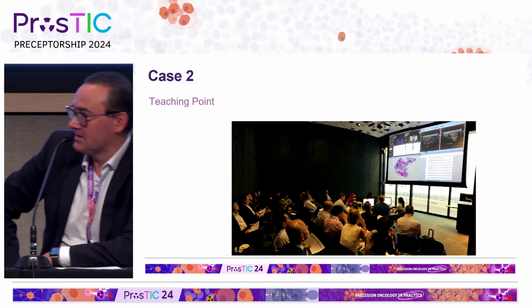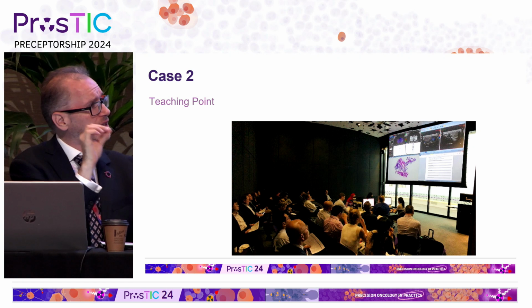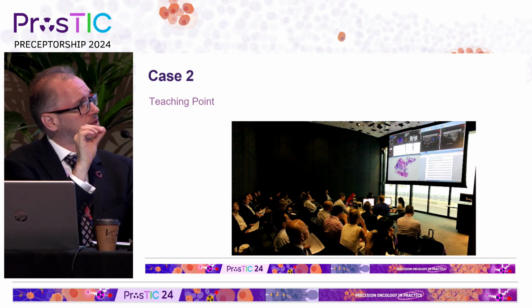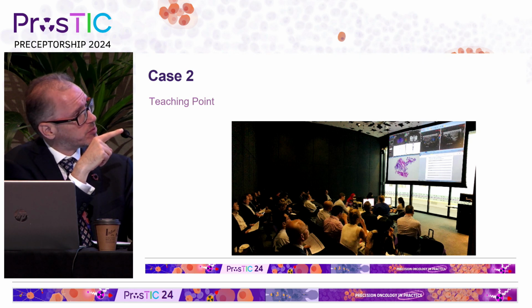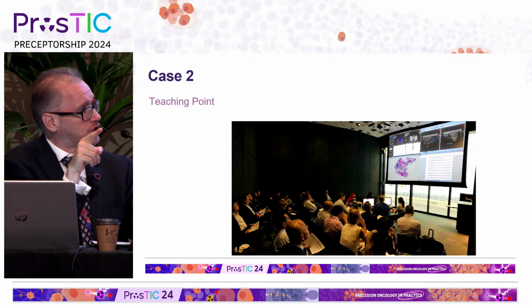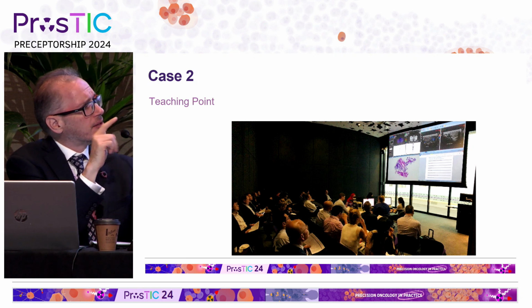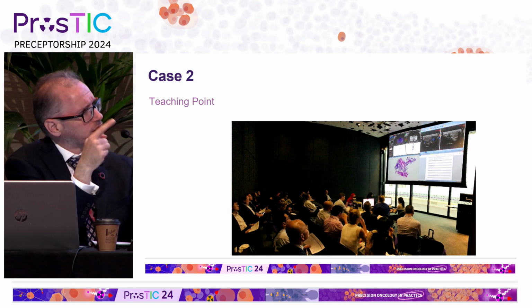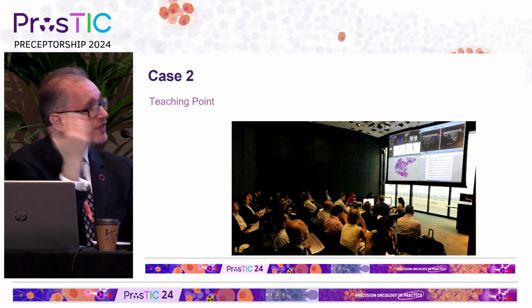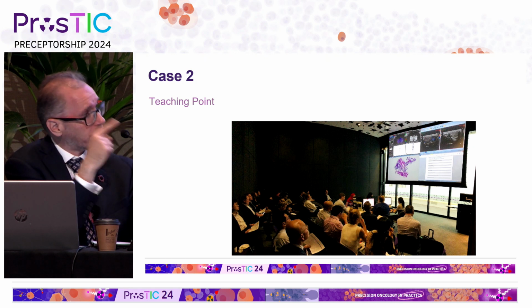I want to caution that approach because this is actually quite an unusual scan, because the focal intensity of uptake is super high. You can call it a metastasis easily. I've seen a hemangioma like this get stereotactic radiotherapy because it was a presumed metastasis, but the PSA didn't change at all. And then an FDG was done and metastases were seen elsewhere. But I think my key message is that most bone metastases from other causes have really low intensity uptake. It's very unusual to have SUVs of 15 or higher that are really focal, and the main differential there is a hemangioma like we just saw.